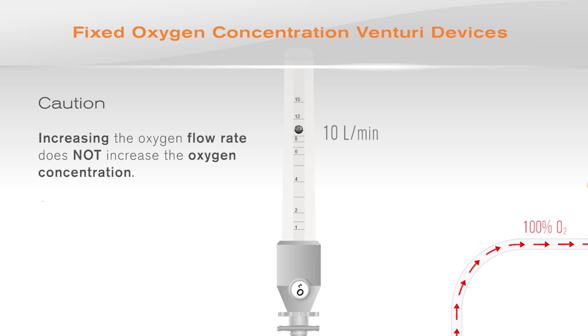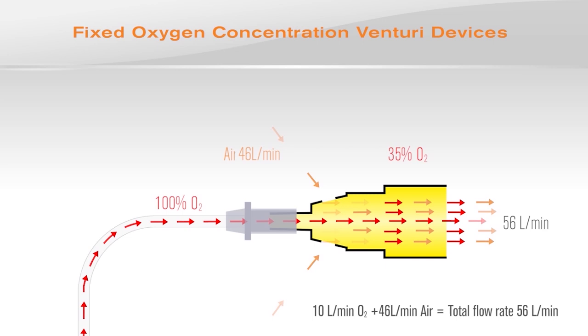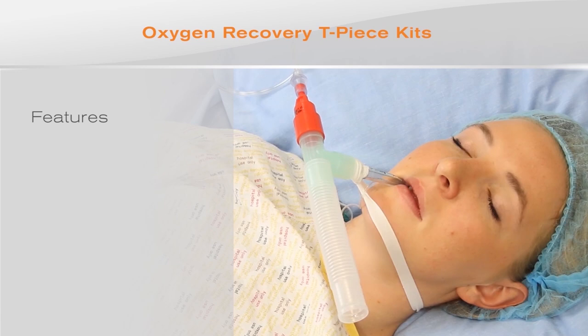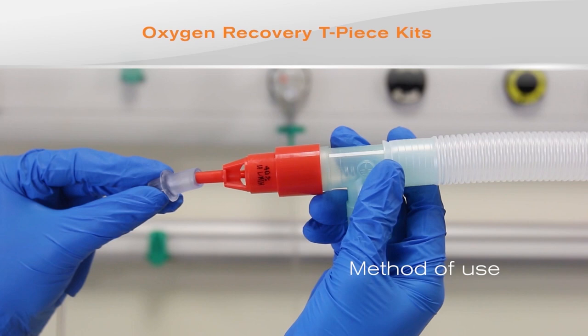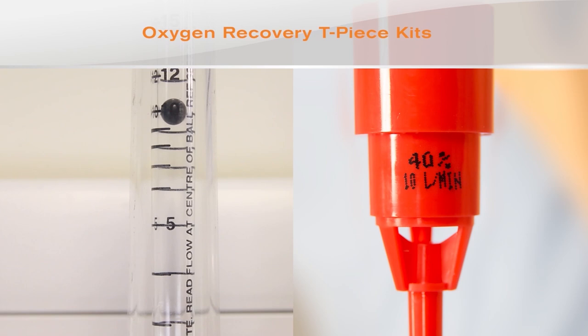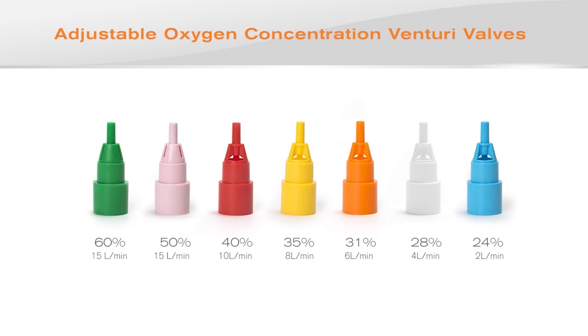Fixed Venturi valves can also be incorporated into oxygen recovery T-piece kits, the most popular being the 40% valve. These are used to provide spontaneously breathing, intubated patients with supplementary oxygen during transport and in the recovery room. A disadvantage of fixed concentration Venturi valves is that in order to change the concentration delivered to the patient, it is necessary to change the valve.